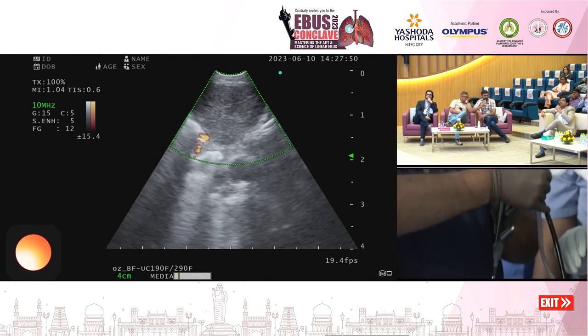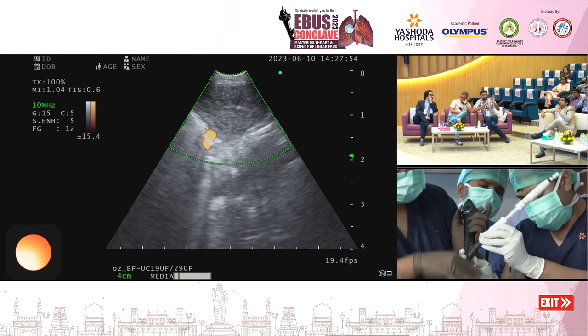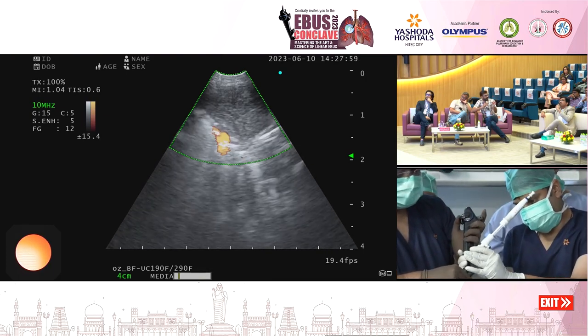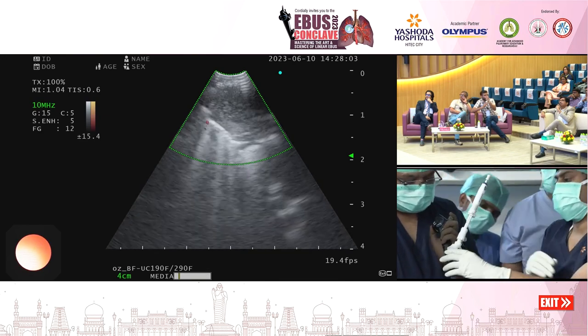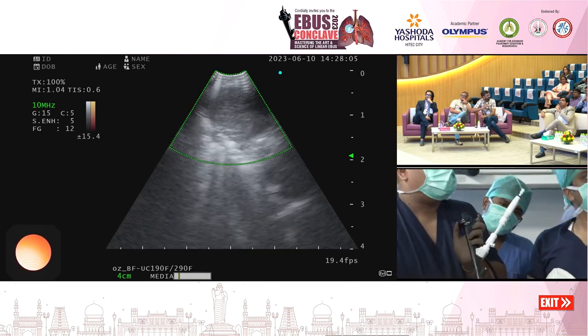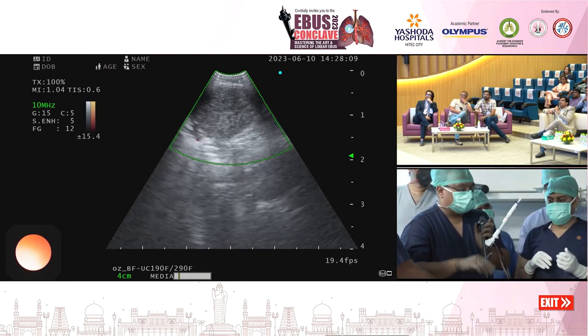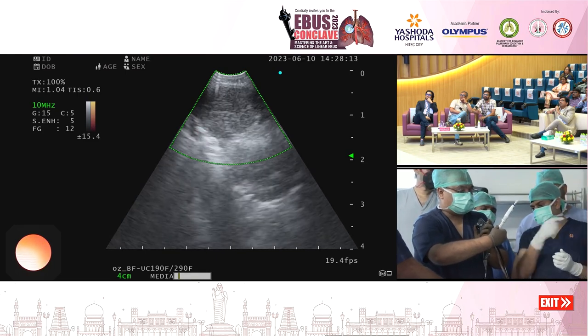Holding the scope is important because while we bring in the sheath and the needle, the scope may lose the contact with the tracheal wall and you might lose the vision. So holding it in position becomes important because we need a non-air interface between the scope and the node which we are visualizing. So we are in position now. Yeah. We had already fixed the sheath. So we have already fixed the sheath. We are in position now.